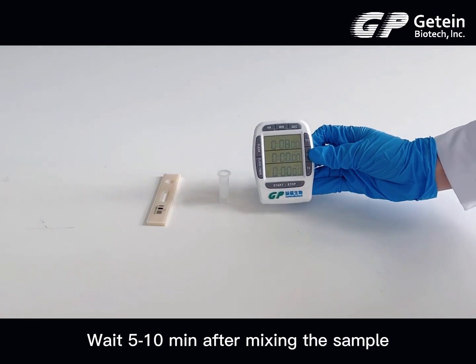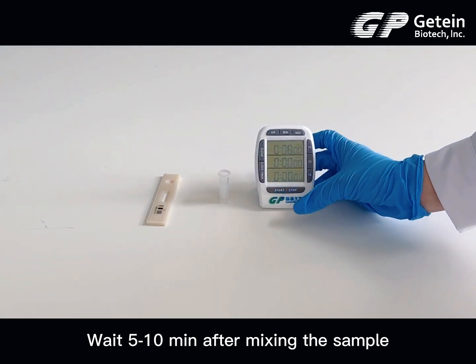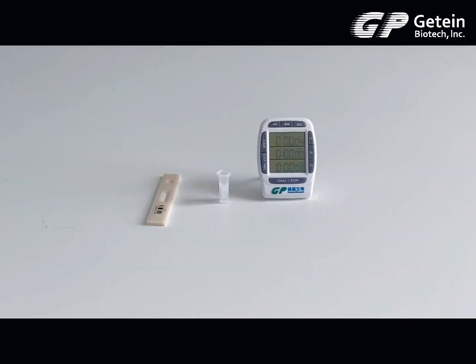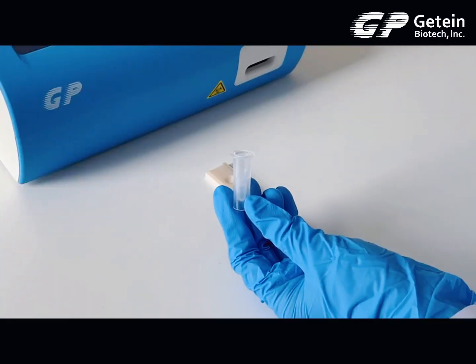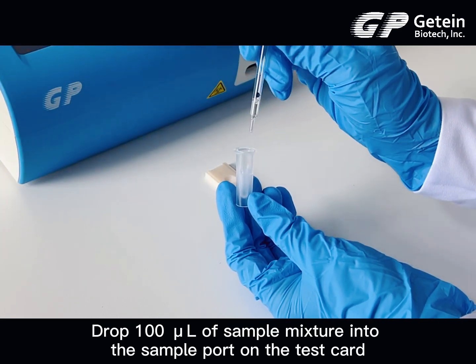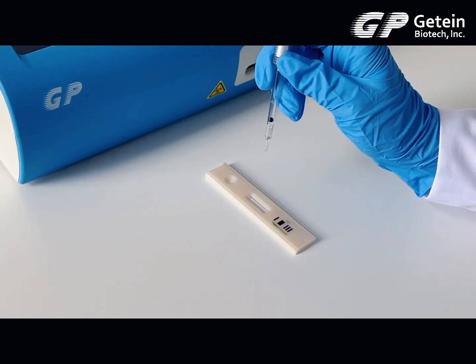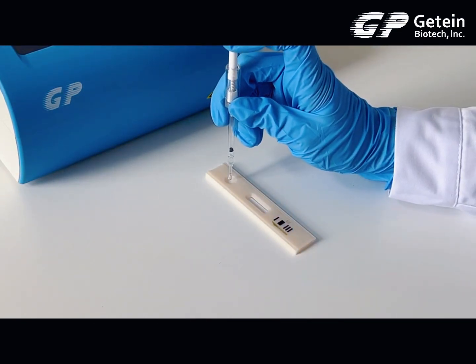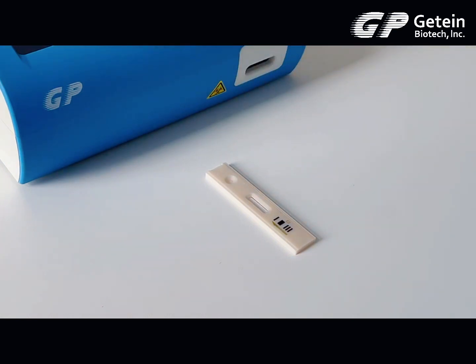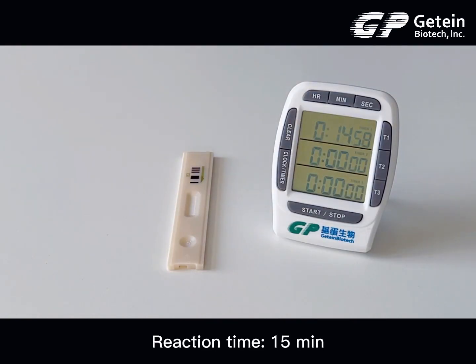Wait 5 to 10 minutes after mixing the sample. Drop 100 µL of sample mixture into the sample port on the test card. Reaction time: 15 minutes.